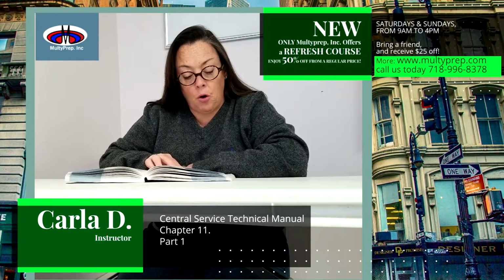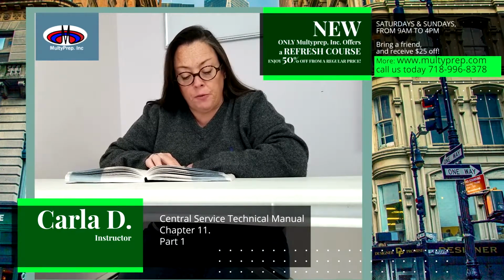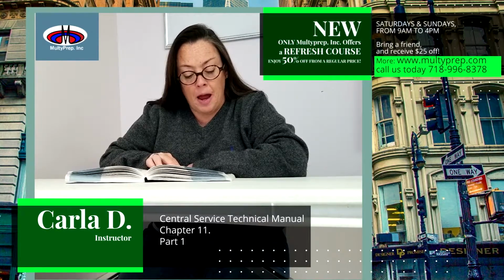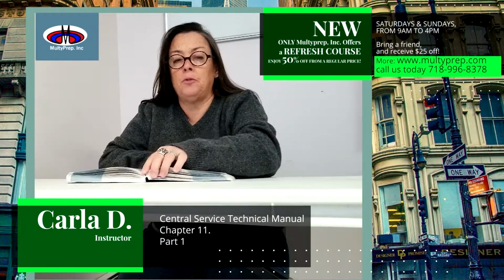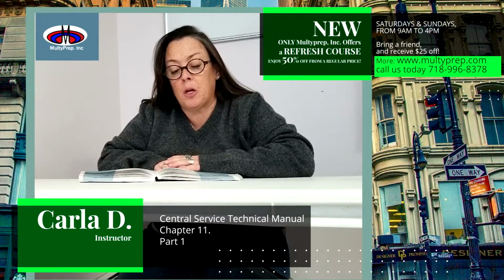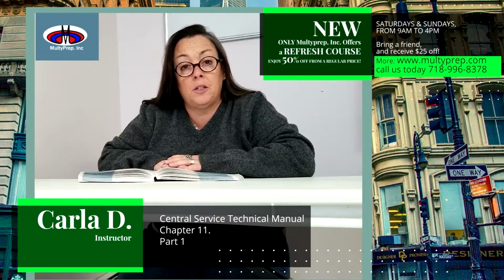Complex instruments are costly to produce and repair, and therefore represent a large financial investment to the hospital. Due to the associated expense, many facilities may not have backup instrumentation available. So careful handling of these instruments is essential. This chapter addresses basic information about some of the complex instruments that may cause processing concerns for CS technicians.